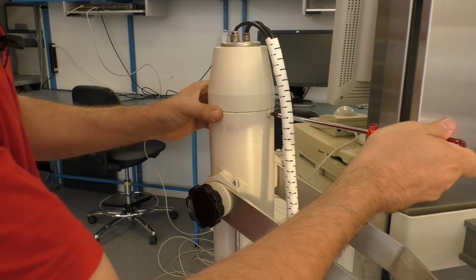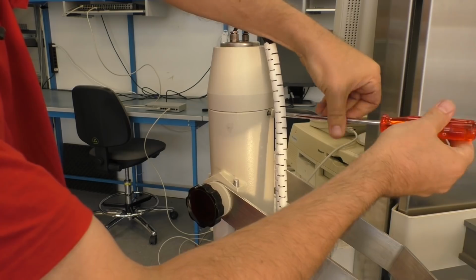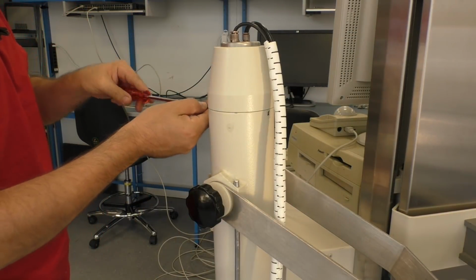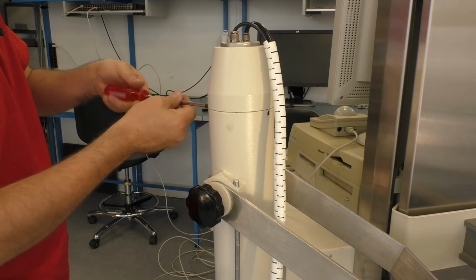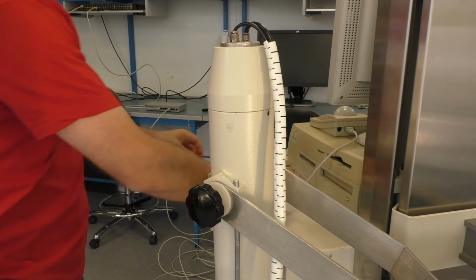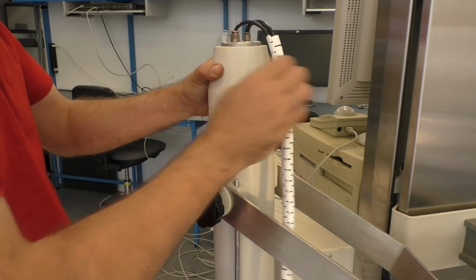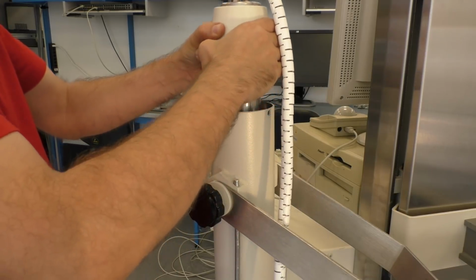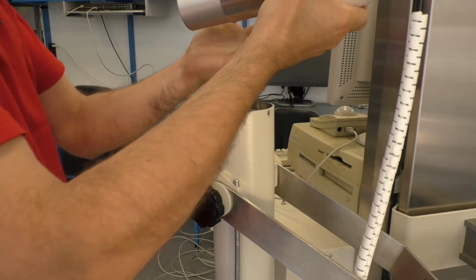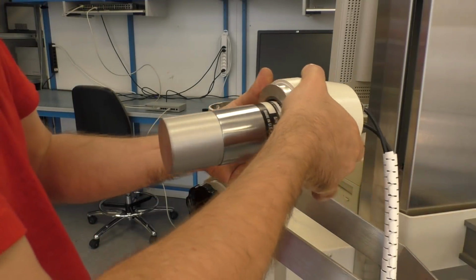There are two screws, one on this side and one on the other side, and of course I have unplugged the mains connection, so there is no high voltage around here, I hope at least. So we can take that out. Okay. Doesn't look very exciting.